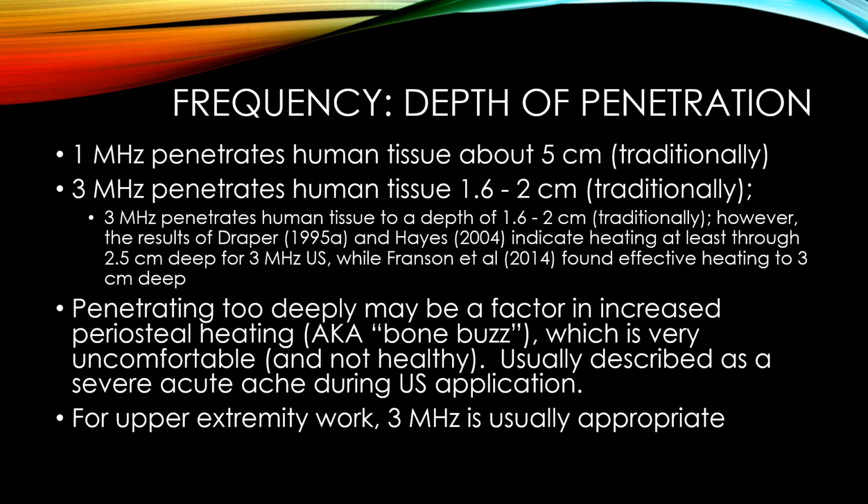If the ultrasound is penetrating too deeply, you may get periosteal heating. Sometimes therapists call this bone buzz. That's uncomfortable. Usually a client will describe that as a severe acute achiness that comes on very quickly, and oftentimes they'll just pull their extremity away.